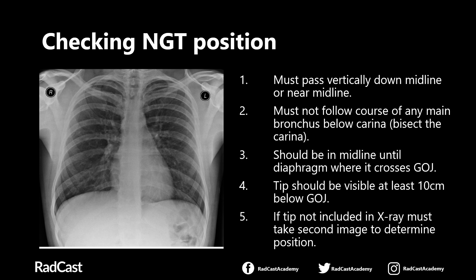Starting at the beginning: the nasogastric tube needs to pass vertically down the midline or near the midline. It may not be straight in the middle, but more or less in the midline. This just tells you that it's passing down a vertical midline structure. Hopefully it's the oesophagus, but it could well be the trachea at this point, as was the case in the example we put up.